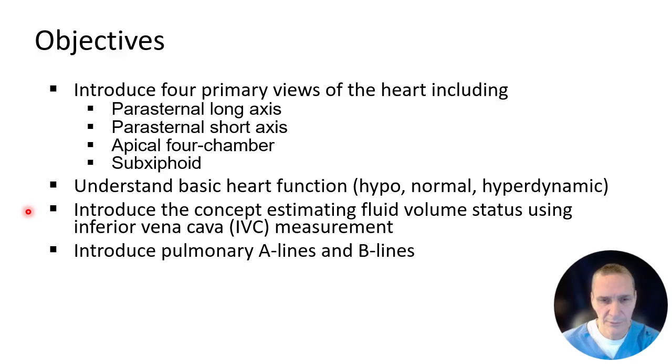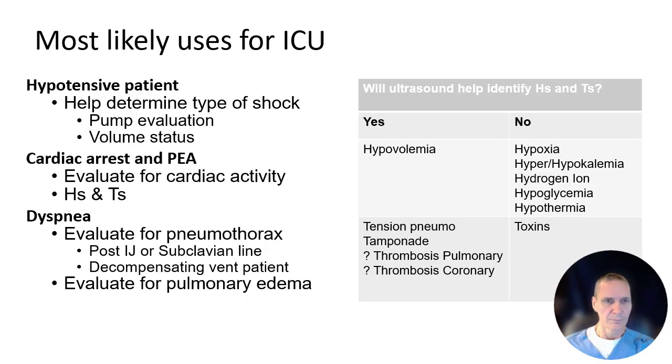I want to talk about the concept of estimating fluid volume status using inferior vena cava assessment, and then introduce the concept of pulmonary A lines and pulmonary B lines.